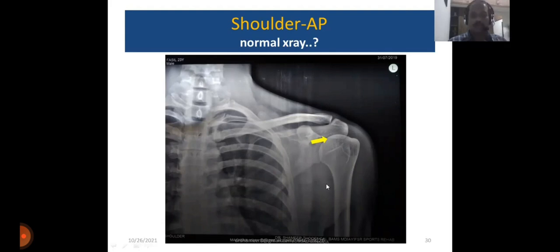All others are normal, because if the shoulder is placed straight, or if the X-ray comes from the top, it will be like this. If it is from straight, you will get a definite 7 mm subacromial space. So it depends on the experience of the technician. So you look into the glenohumeral relation only.